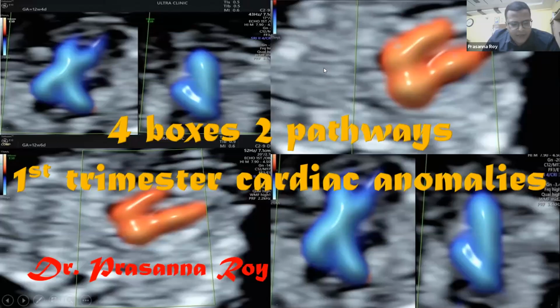Good evening, my respected colleagues and my dear seniors. Now we will start with the panel discussion. We are going to present the same cases in the panel, on the first trimester cardiac anomalies. The title of the panel is very evident: 4 boxes and 2 pathways. The 4 boxes are the 4 chambers of the heart, and the 2 pathways are the 2 outflow tracts.